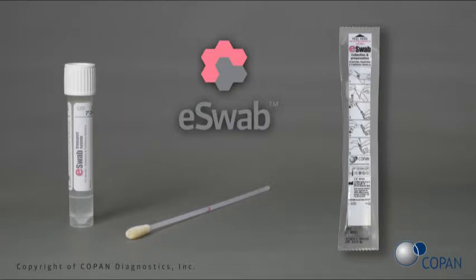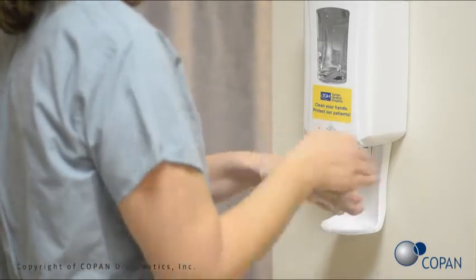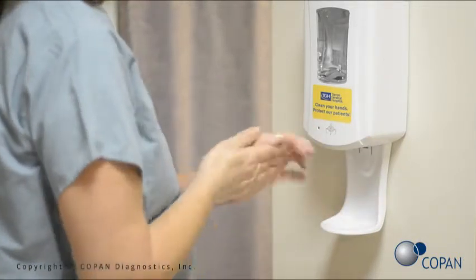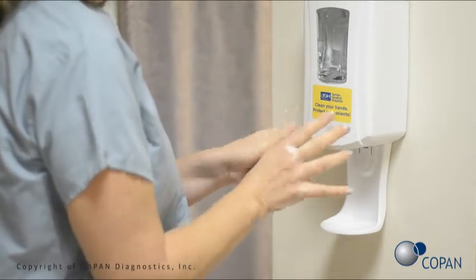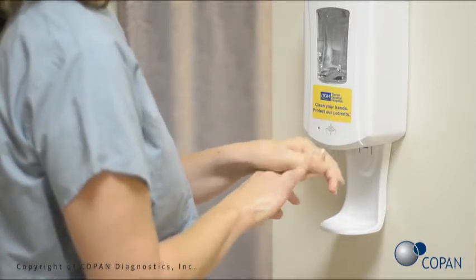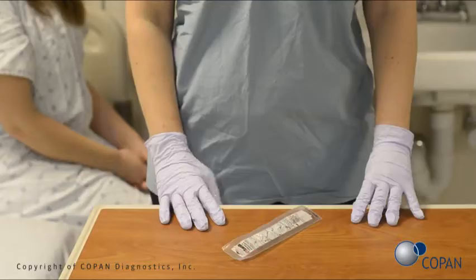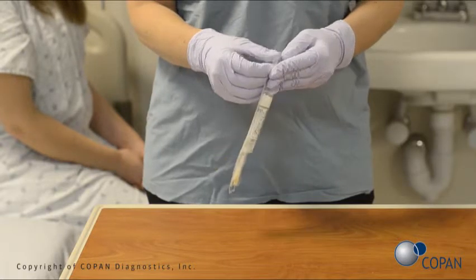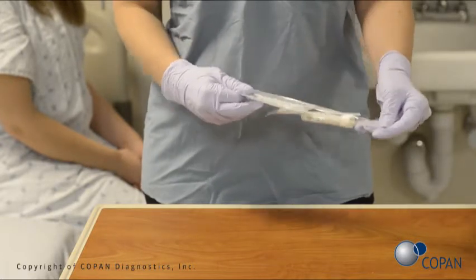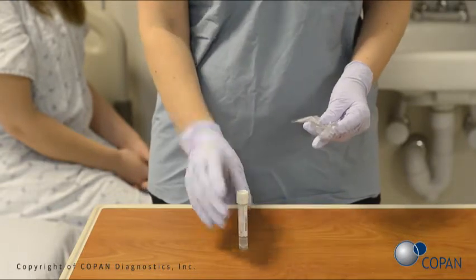E-Swab is easy to use. Perform hand hygiene. Put on gloves. Open the peel pouch. Remove the E-Swab tube from the pouch. Remove the white swab from the pouch.